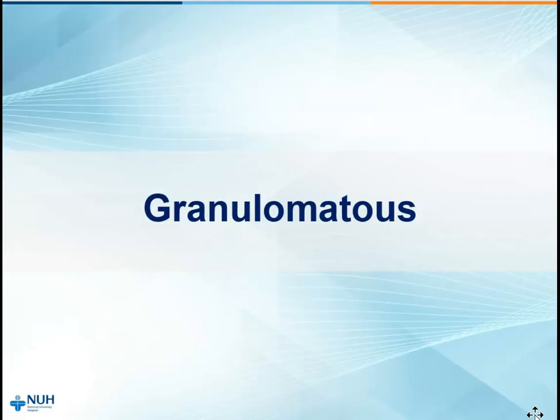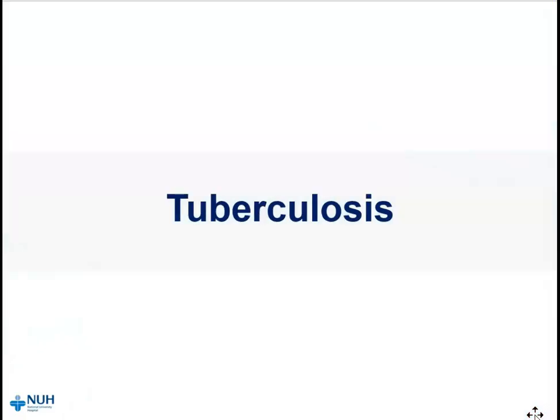Next, we move to the group of granulomatous lymphadenitis. First, we consider tuberculous lymphadenitis. Typically, we see large geographic areas of caseation-type necrosis, which is seen histologically as amorphous eosinophilic necrotic debris that are surrounded by aggregates of epithelioid histiocytes, Langhans-type multinucleated giant cells, lymphocytes, and plasma cells.